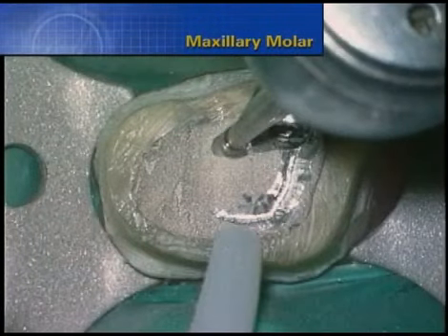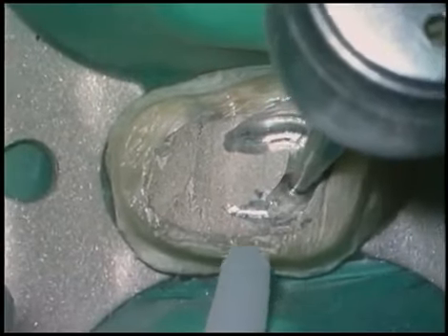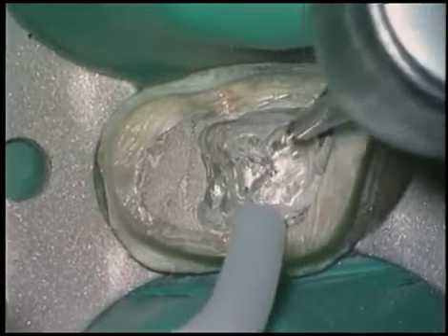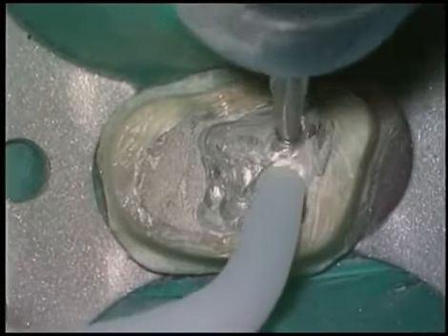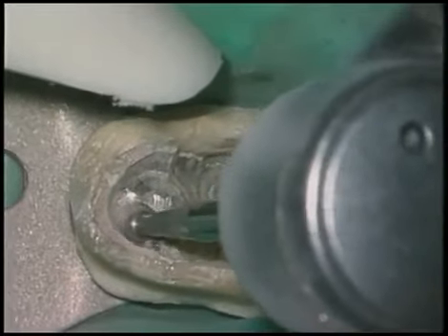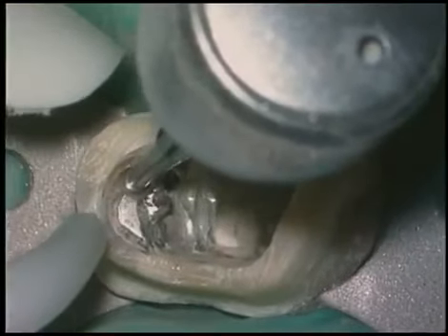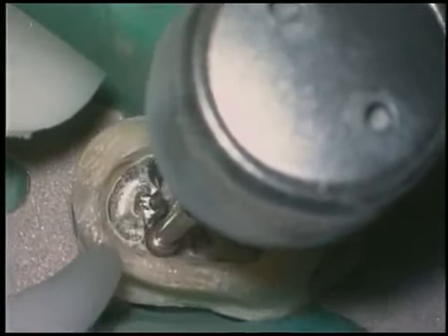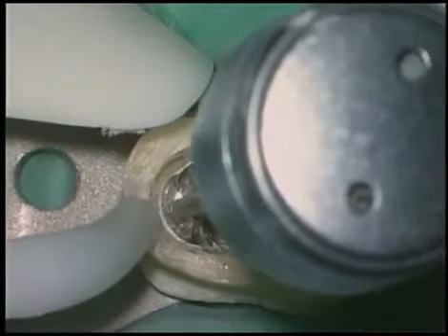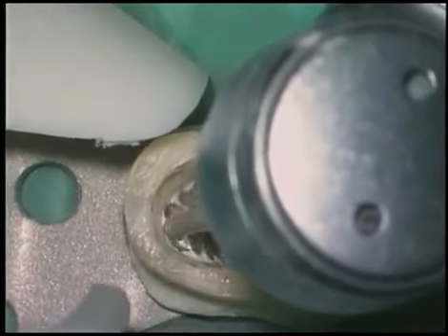In this maxillary molar, the buildup material is an amalgam core. Amalgam cores can be tedious to remove, so simplify the procedure by progressively brushing away this material, being careful to not foreshorten the post. Be careful that you make the distinction between amalgam and post. They're both colored silver, so we could inadvertently and needlessly foreshorten the post. So just sculpt away very lightly out on the perimeter. This will keep the post intact.